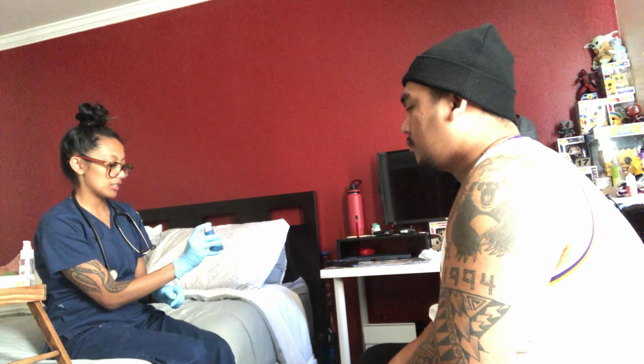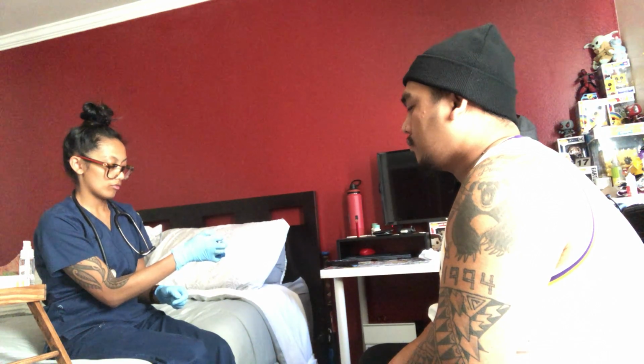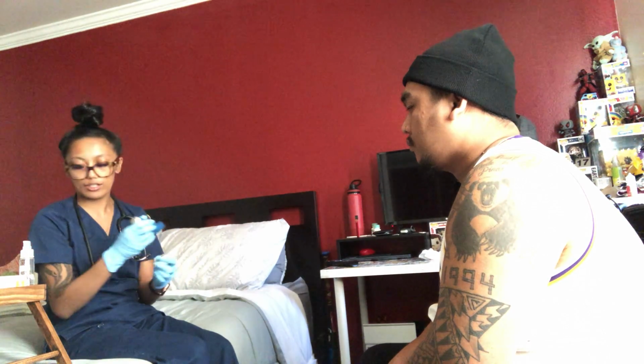Okay, so once it's ready, I'm going to just place it in. And then to prime it, you're just going to press away from you like this. Do it at least twice. You do want to prime it if you haven't used it within 1 to 2 days. You always just want to shake it up and then prime it away from you.